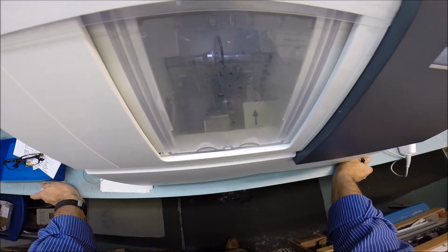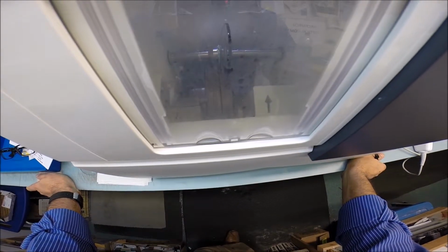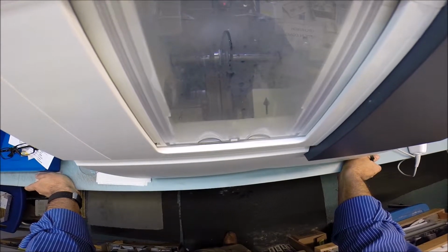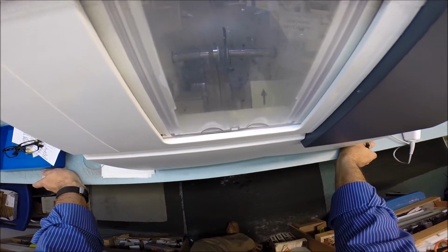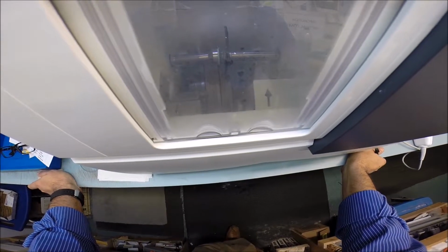Now in just a moment, your lens will come down onto the cutting wheel. It is actually starting very slowly. If you heard me mention before, this is on the slow cycle because of the anti-glare. Although I called it the soft cycle, it means it just cuts slower. But in just a moment, and the moment is now, your lens will begin cutting.